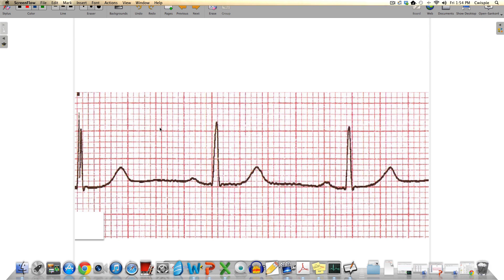Welcome back everyone. Let's take a look at the EKG paper and see all of the standards that we need to know. We'll talk about all the important information that lies on this piece of paper, including the paper speed and the calibration of the machine itself. We need to make sure we're always using the right calibration and the right set of rules for interpretation based on that calibration.